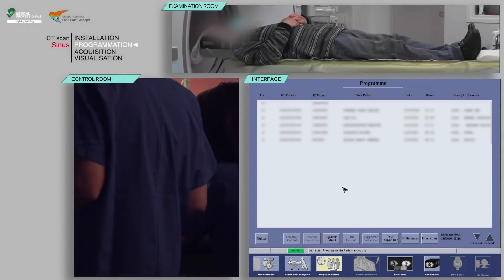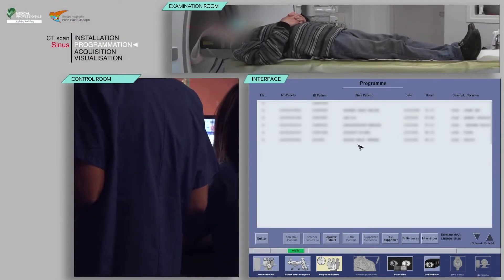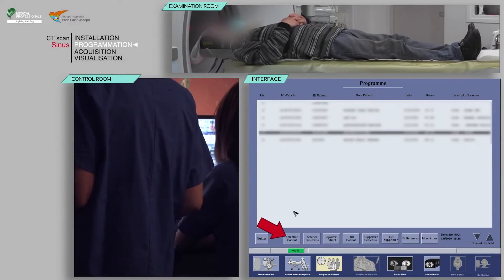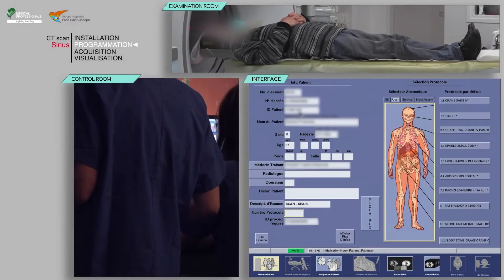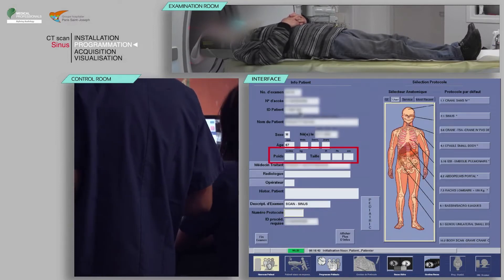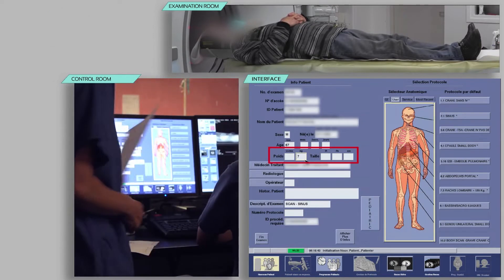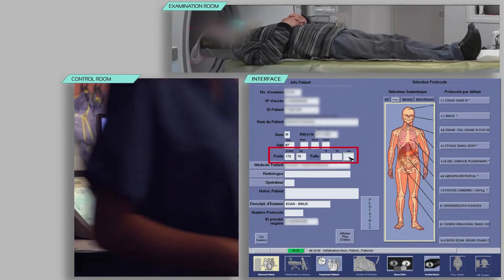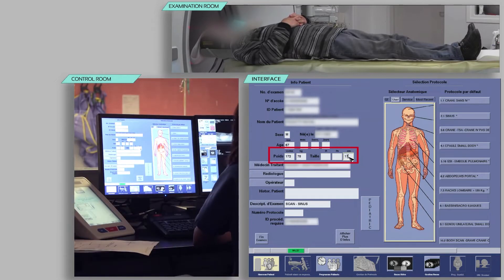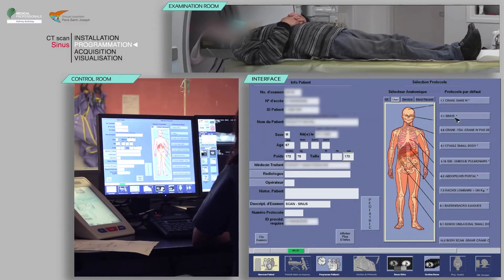Select your patient from the work list, then click on patient selection. Verify the pre-filled information and fill in the patient's weight and height. Finally, choose the appropriate protocol.